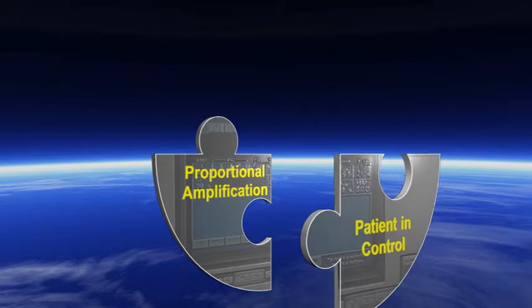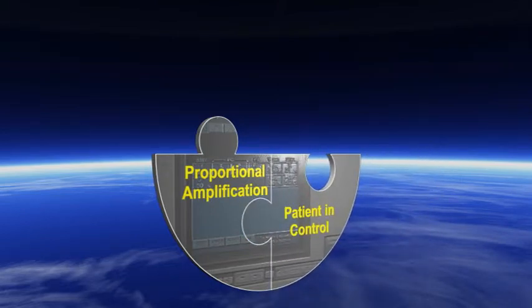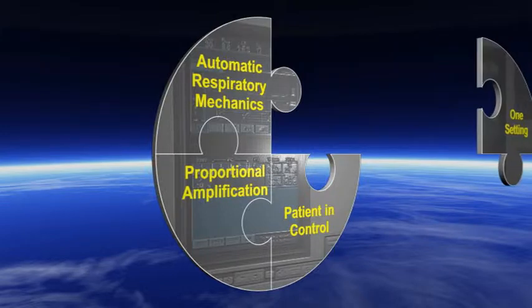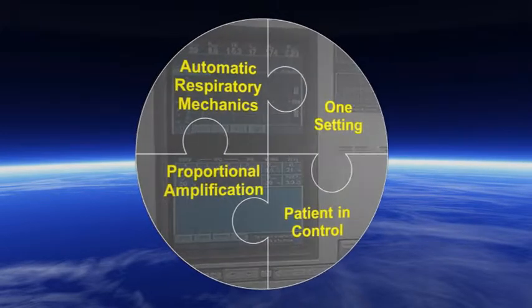PAV Plus's objective is to allow the patient to comfortably attain whatever breathing pattern his or her control system desires. The main goals of PAV Plus are synchrony and adaptability through the automated measurements of both demand and respiratory mechanics. Percent support is your primary setting.